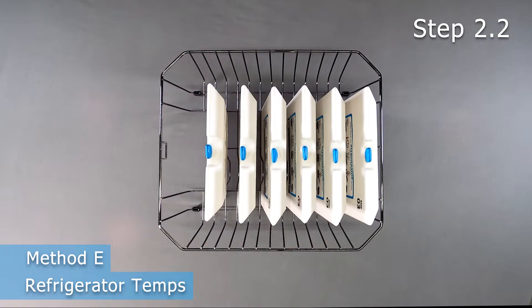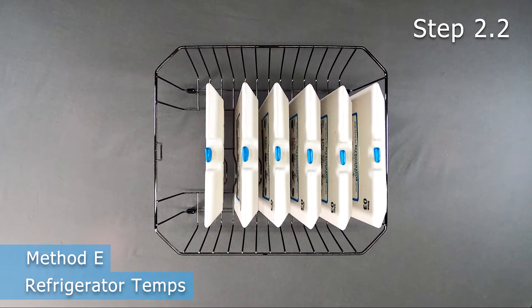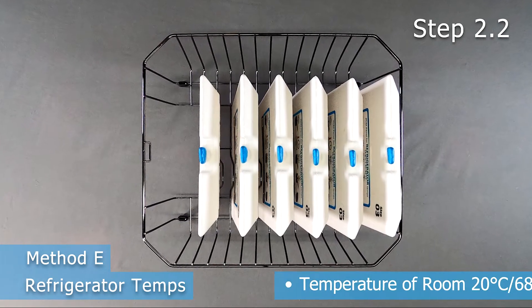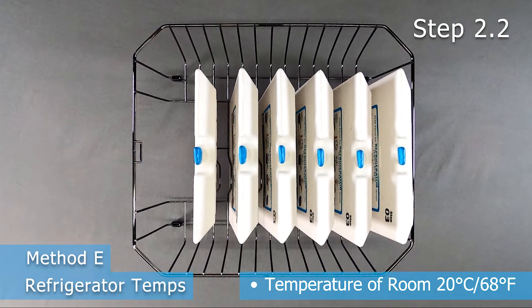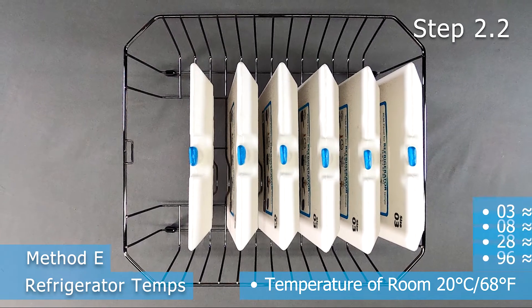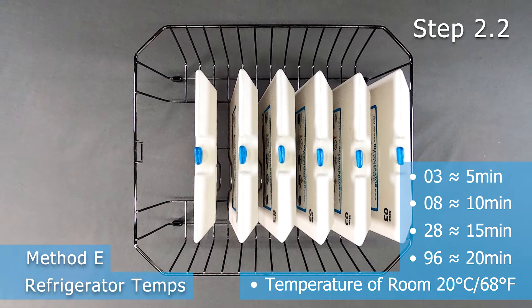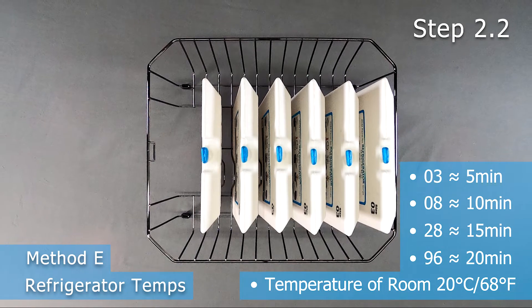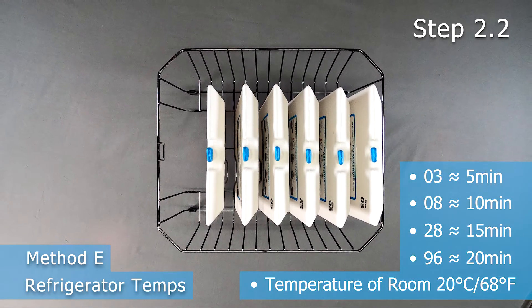The time varies depending on the size of the panel and the temperature of the room. We recommend a room temperature of 20 degrees Celsius or 68 degrees Fahrenheit. If your room is slightly warmer or cooler, adjust accordingly. We recommend 5 minutes of staging time for the CoolCube 03, 10 minutes for the 08, 15 minutes for the 28, and 20 minutes for the CoolCube 96.